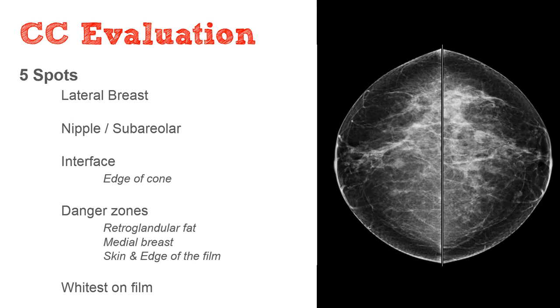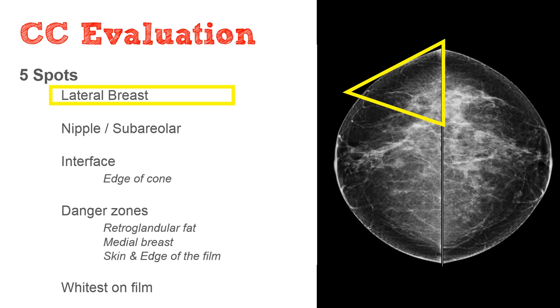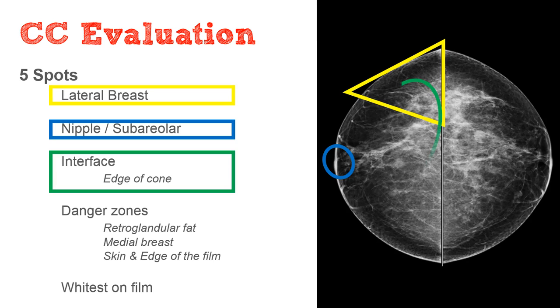Then we want to make sure we look at the 5 key spots not to be missed on the craniocaudal view. And these include the lateral breast, as the majority of breast cancers occur out laterally. Next, we're going to look again closer in that nipple subareolar region. From there, we're going to do this edge of the glandular cone. Again, at that interface, a majority of cancers occur.